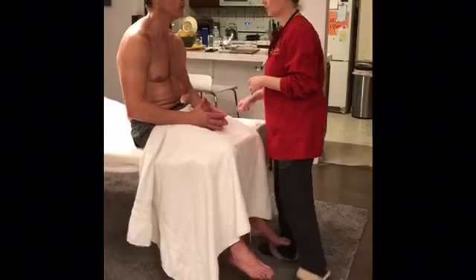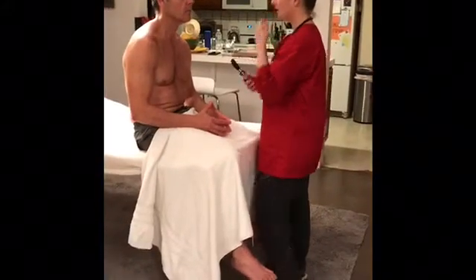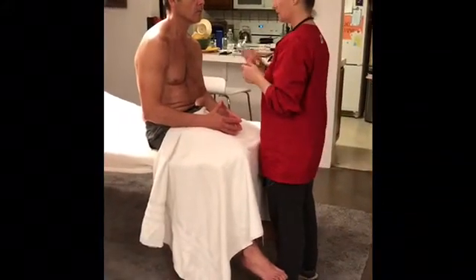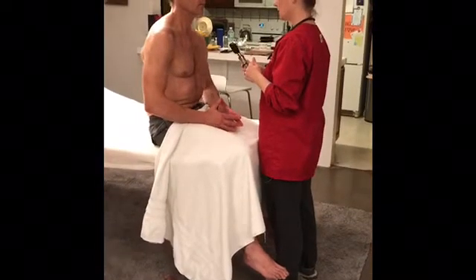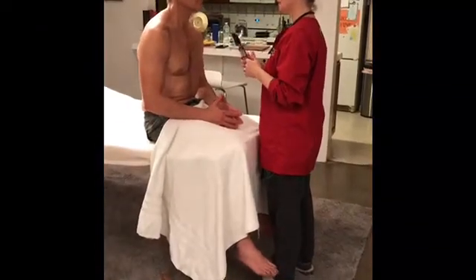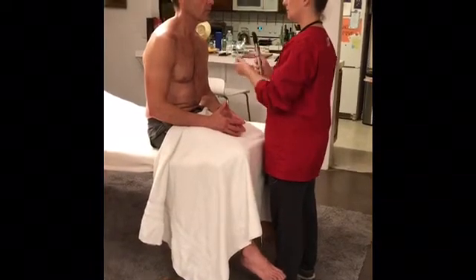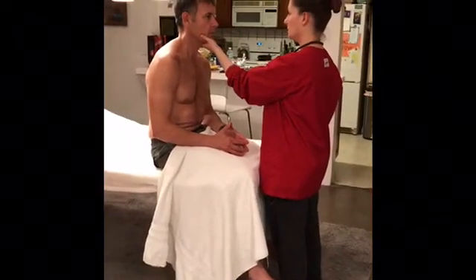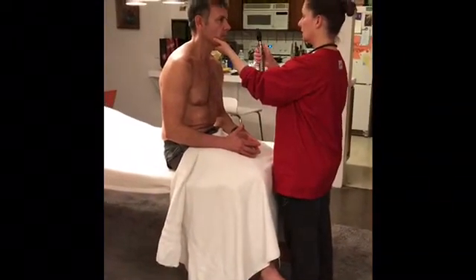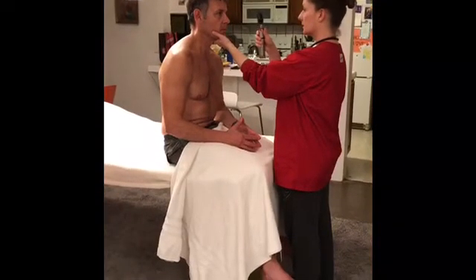And now we're going to move on to the fundoscope test, where we're going to look at the inside of the patient's eye using the machine. We're always going to go right eye to right eye and left eye to left eye, making sure that we don't bump the patient's nose. So first we would start off having the patient look straight ahead. Put your chin down, open your eyes, and we turn this on and look for the red reflex in the eye.